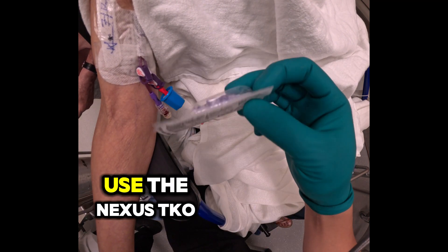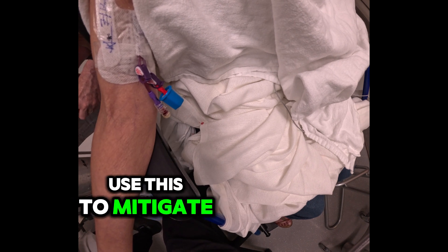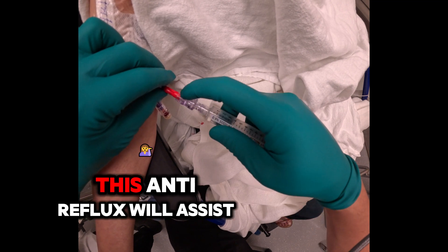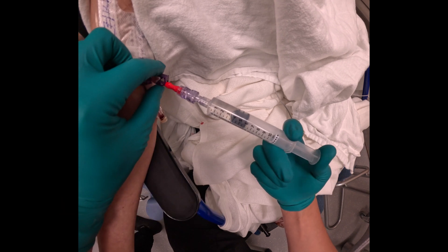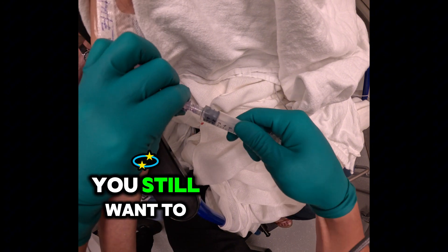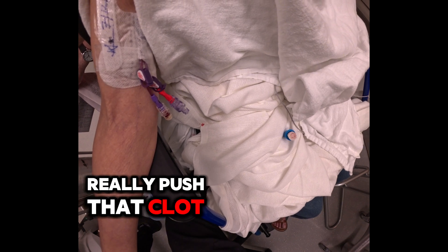Today we're going to use the Nexus TKO because our needle is connected since she's had reflux issues, and we're going to use this to mitigate those complications. So if the nurses, she, family members, or whoever's helping forgets the clamping sequence, this anti-reflux valve will assist. Even with these, you still want to clamp in the proper clamping sequence — flush, not all the way, a gentle flush out and then clamp. You still want to follow that clamping sequence and really push that clot out of the way every time.